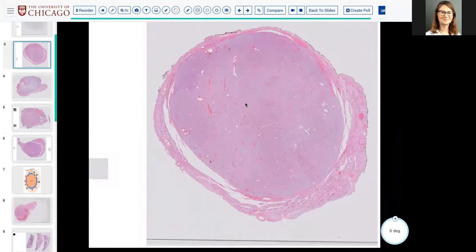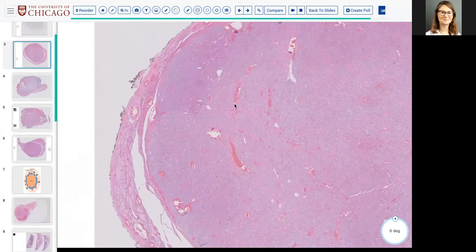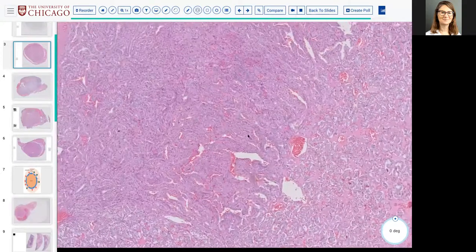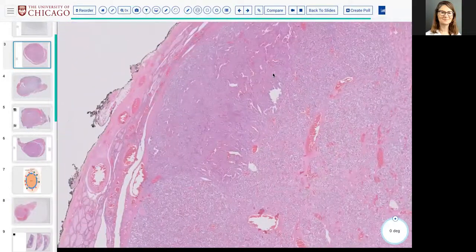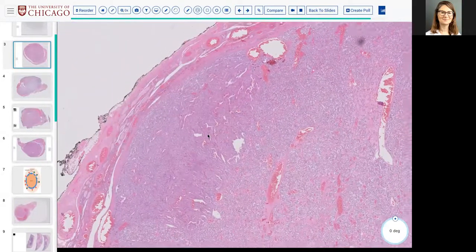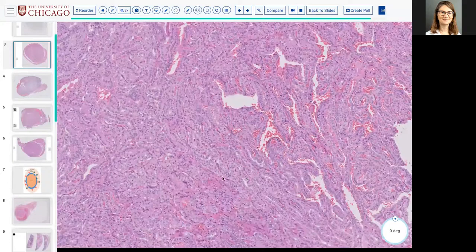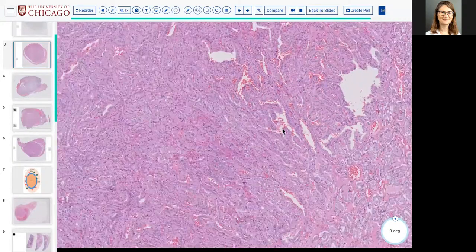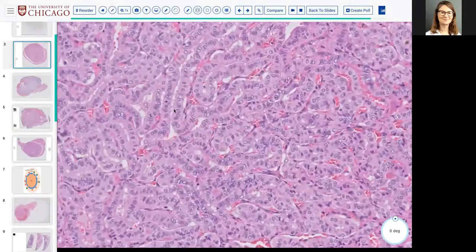Some studies say the entire lesion, not just the periphery, but the entire lesion, because you may find areas of architectural papillae, especially for people who don't have access to BRAF immunostains or molecular testing. You may find areas of complex branching papillae, which in this case, we actually had a nice area. It's sort of like a little wedge-shaped area at one corner of the entire 2-3 centimeter tumor, with very long, almost tall cell-like structures, but more complicated architecture with arguably some here.